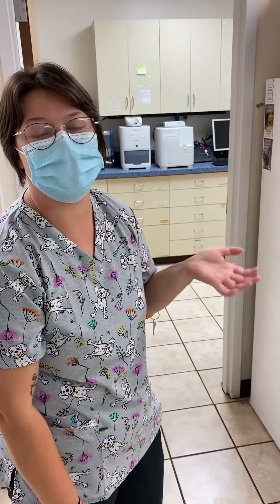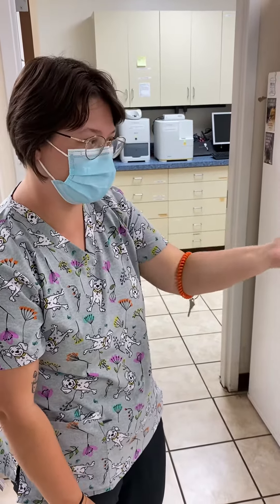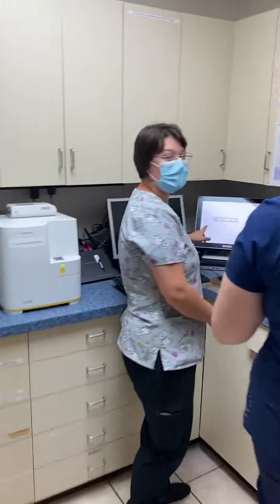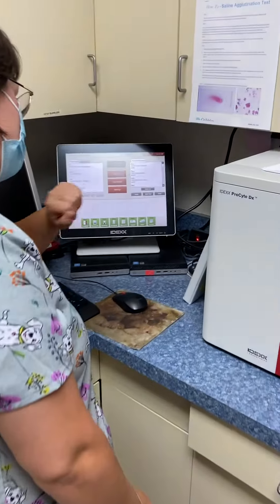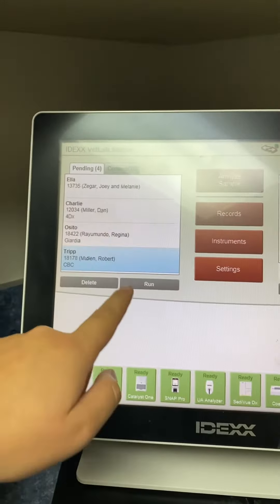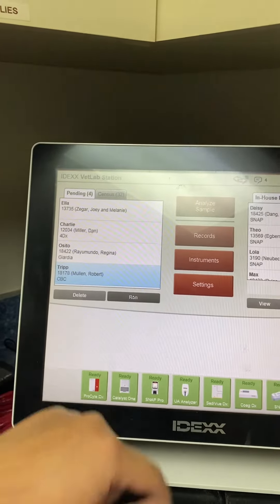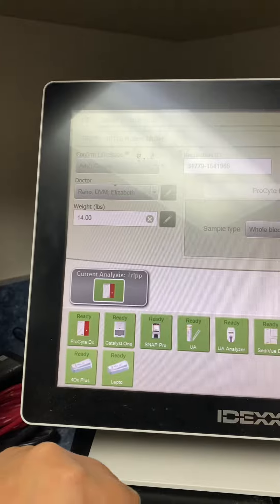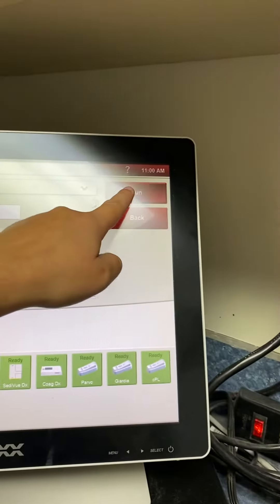We already added the CBC in-house onto the account for this Tripp character. So we are going to take it in here to the lab. On our IDEXX computer, we're going to find the name of our patient, Tripp, and press run. You want the ProCyte machine since we're doing a CBC only, so go to run.